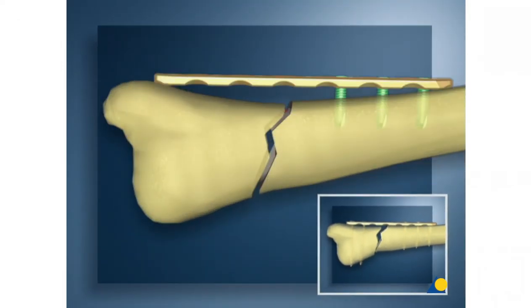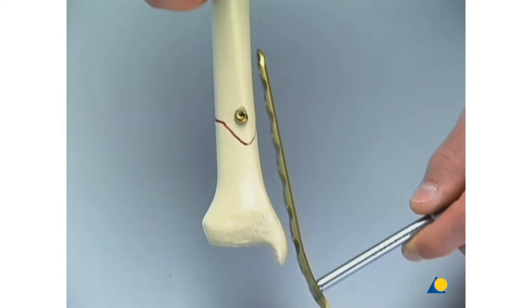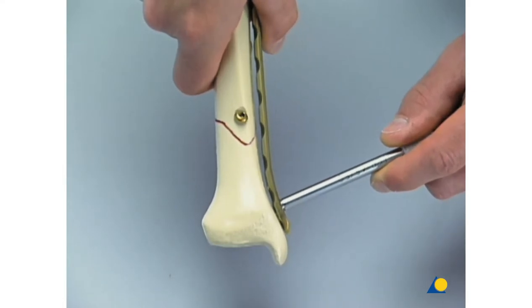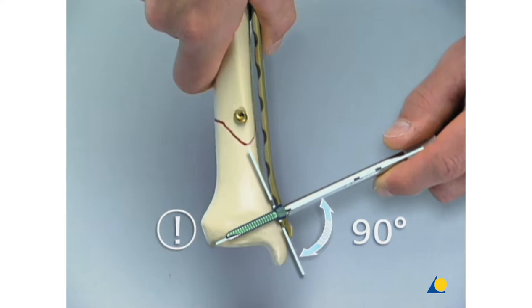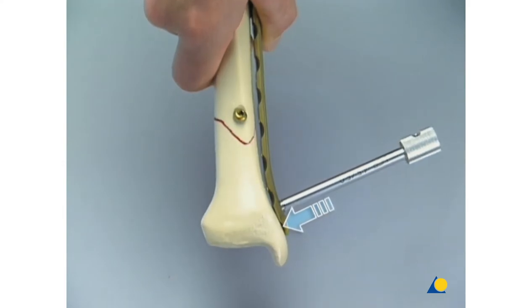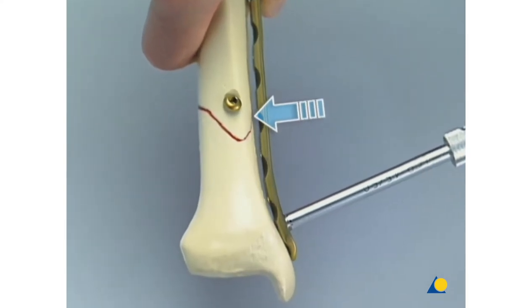This disadvantage does not arise if an LCP with locking head screws is used. Therefore, this plate does not have to be pre-shaped absolutely anatomically. The LCP has been slightly bent at the distal end. The plate with the LCP drill sleeve screwed into the most distal hole as a handle is gently inserted and slid along the medial aspect of the tibia. As the locking head screws cannot be angled, care must be taken when positioning the plate to prevent screw penetration of the joint. Moving proximally, the plate does not touch the bone, nor will it need any additional contouring or torque.